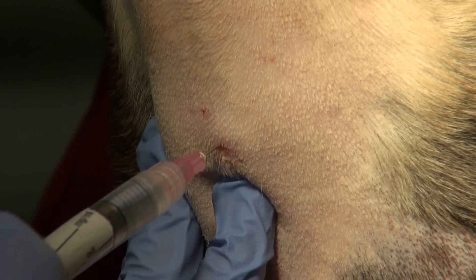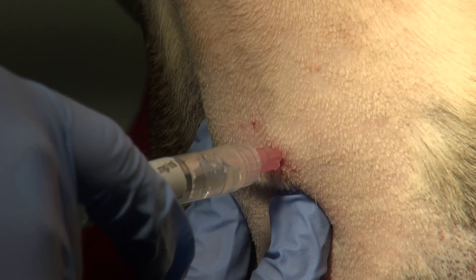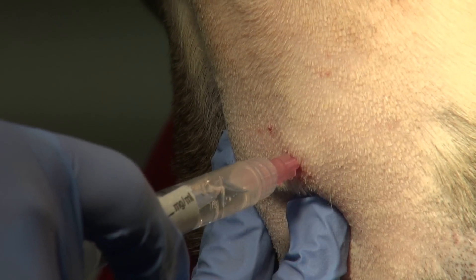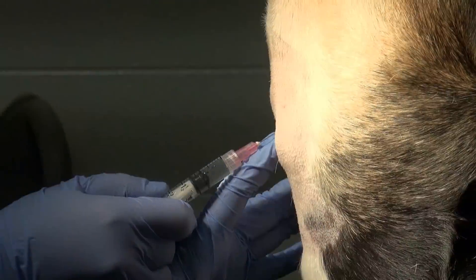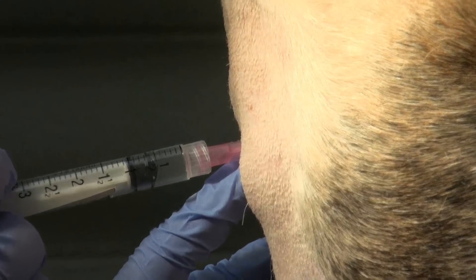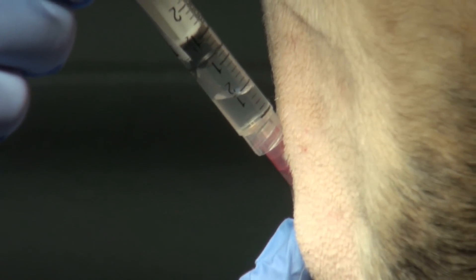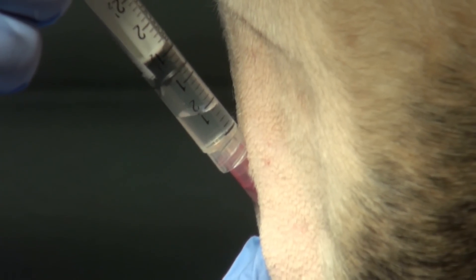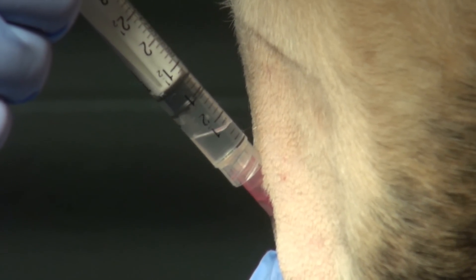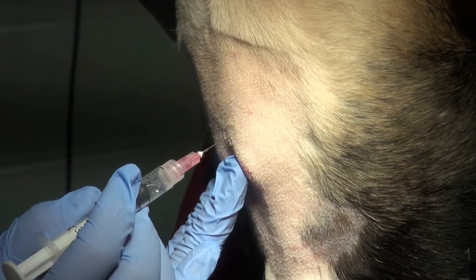We inject lidocaine ahead of the needle as it advances, then enter the cricothyroid ligament and aspirate to confirm we're getting air. Here the needle was off the midline — we got a vacuum instead of tracheal gas — so we back the needle out, repalpate our landmarks, and try again. This time we successfully aspirate air from the trachea. Tip the syringe up to move the bubble away from the needle, then inject a little more lidocaine into the tracheal lumen and subcutaneous tissue while withdrawing. It's important to keep the air bubble away from the needle so you don't inject air subcutaneously.